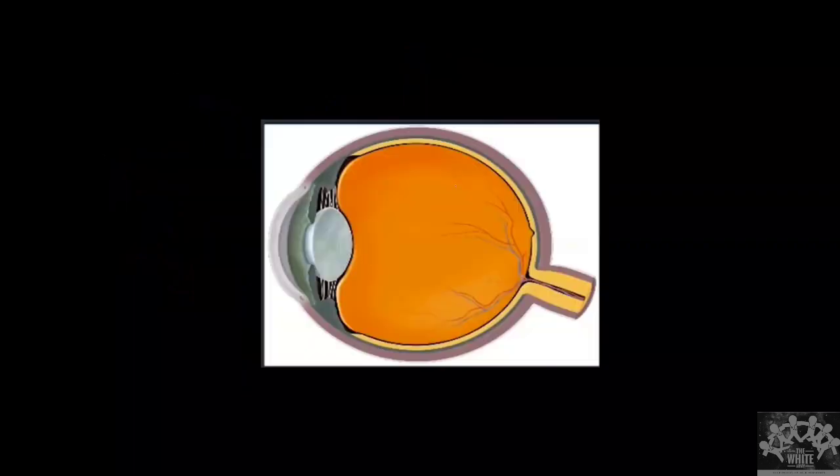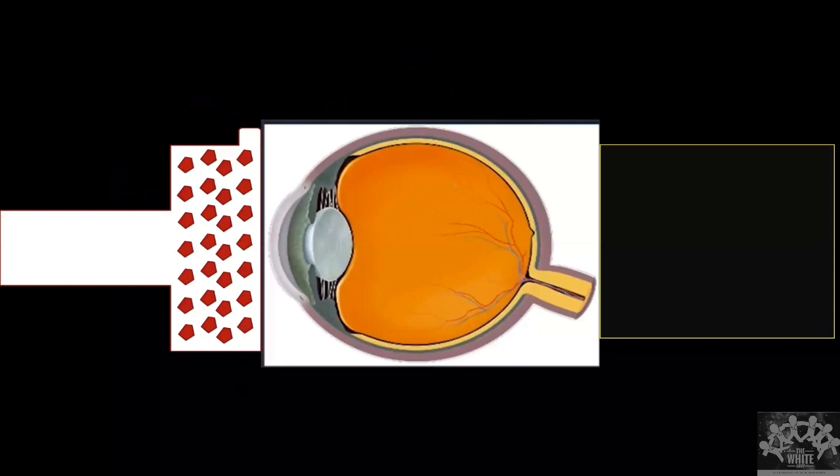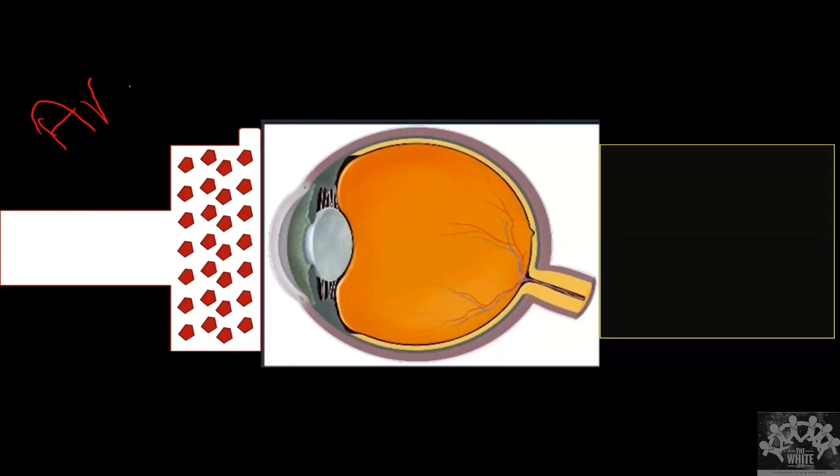Now, this is an orbit. Now, I will tell you different modalities of ultrasound. Okay, you need to know different modalities of ultrasound. I'll just brief you about how exactly imaging was started, from olden days. The probe can be kept on the orbit to image the orbit, and that's how what we used to call the amplitude scan, or A scan, was done.